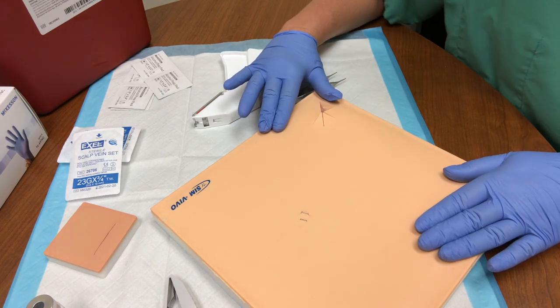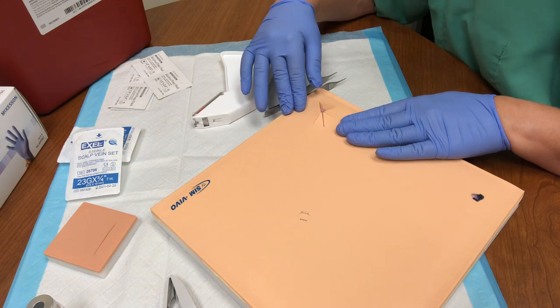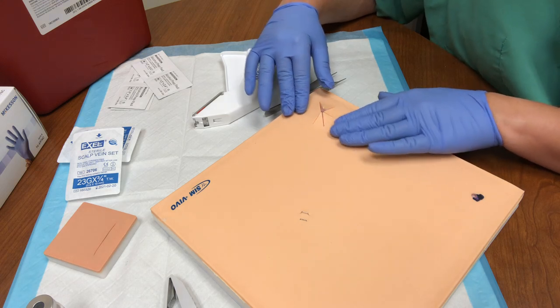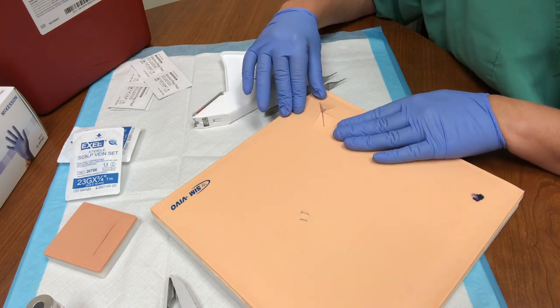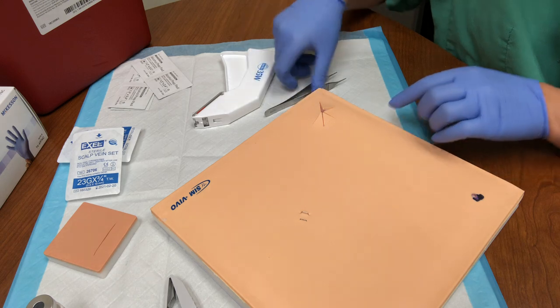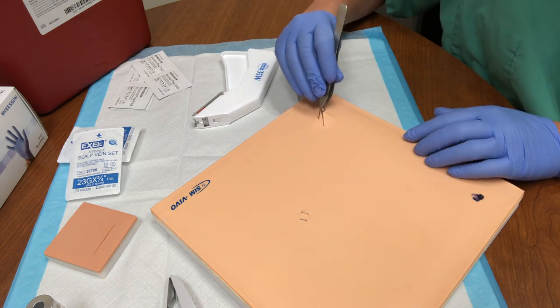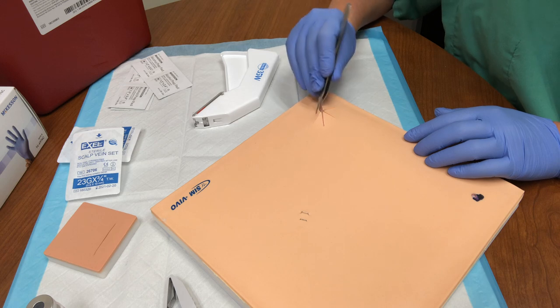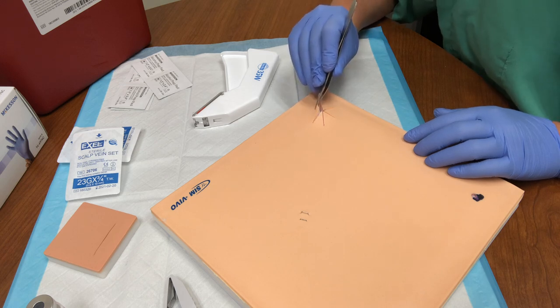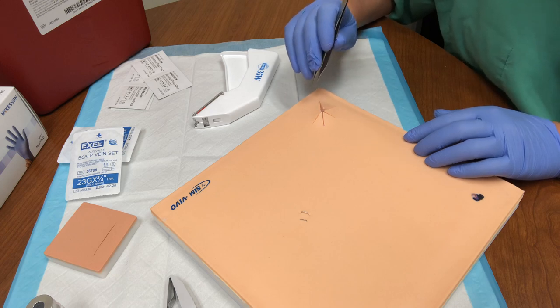Today we're going to cover the stellate laceration that would typically come in on someone's head, but any joint space may have this — an area involved with excess tension. The concerning thing is how do you pull all of these points back together without placing too much tension on the underlying tissue and without compromising vascularity to those structures. We're going to demonstrate that today.